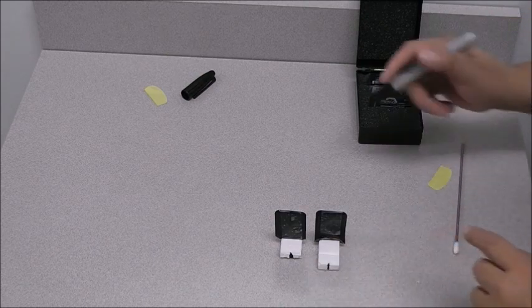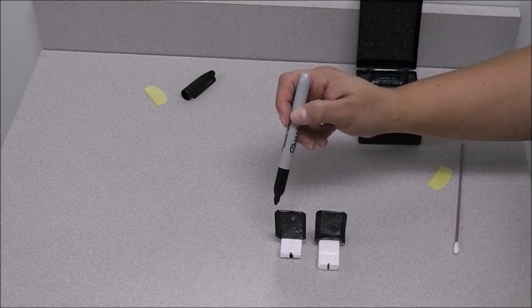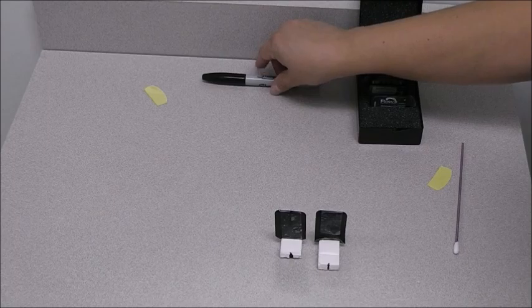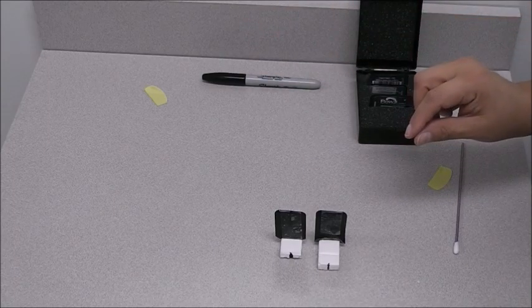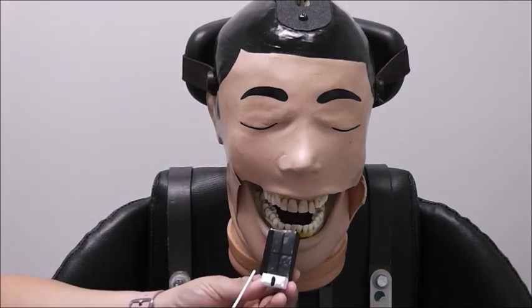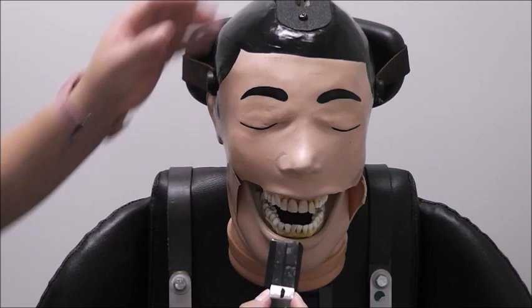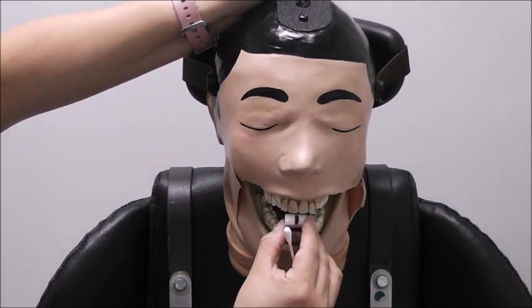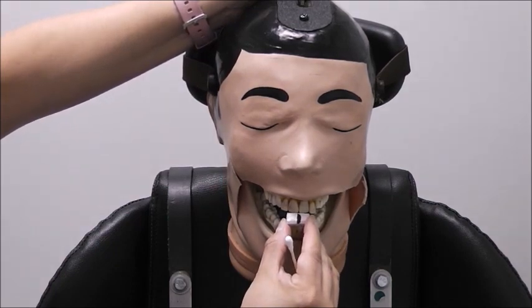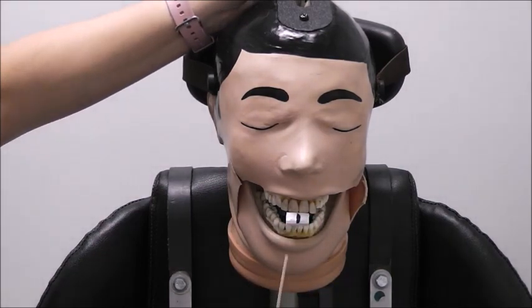Here I broke off the bite block on one edge, and on this one I left it on — depending on the patient's occlusion. Now I'm going to show you the placement in the patient's mouth for the anteriors. We're going to center the bite block in the interproximal of number eight and number nine, so the black side goes towards the teeth. Bring it up against the teeth, place it in the interproximal of eight and nine, and close it gently. This is our guide, making sure it's in the center of eight and nine.